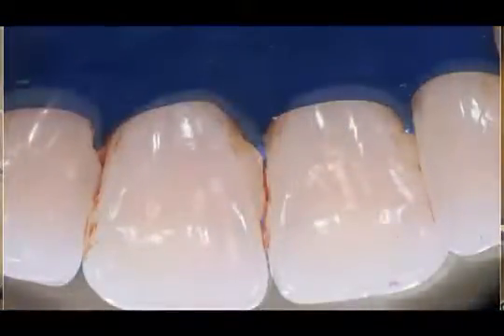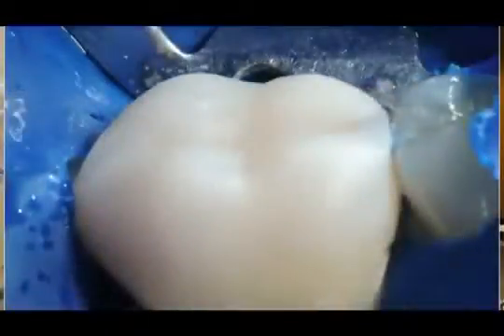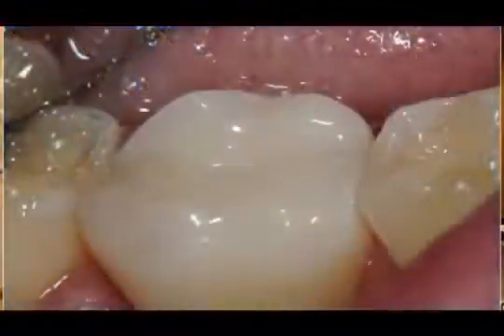So we've put together a very interesting and beautiful way to do minimally invasive, infinity edge, beautiful, natural looking composite finishes. Now, it should take between 30 seconds and 3 minutes, depending on the tooth, to do this beautiful finish. And it's a little counterintuitive. It's not what you're going to expect.